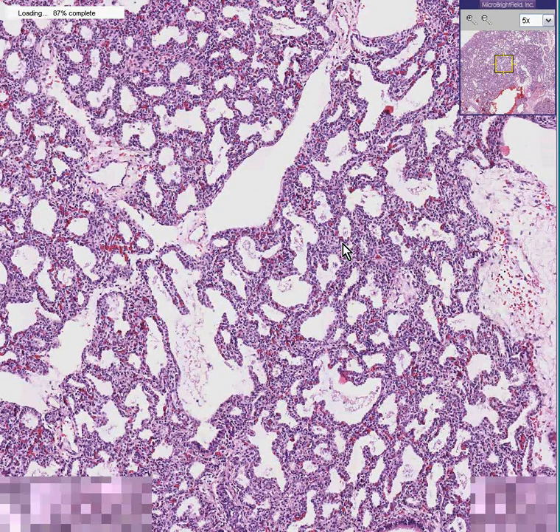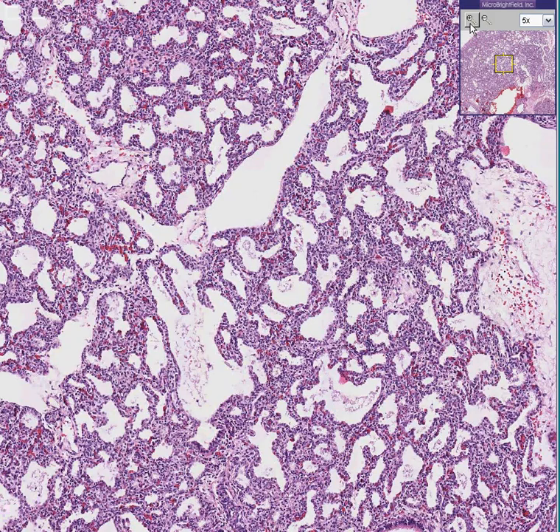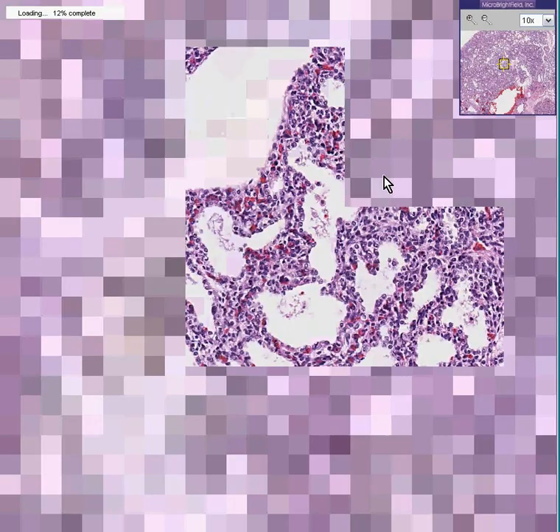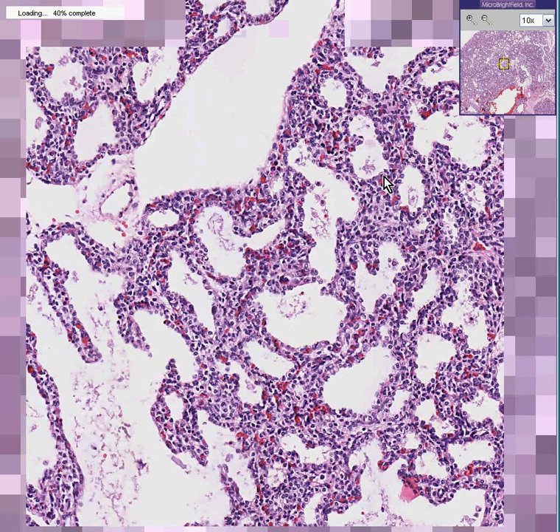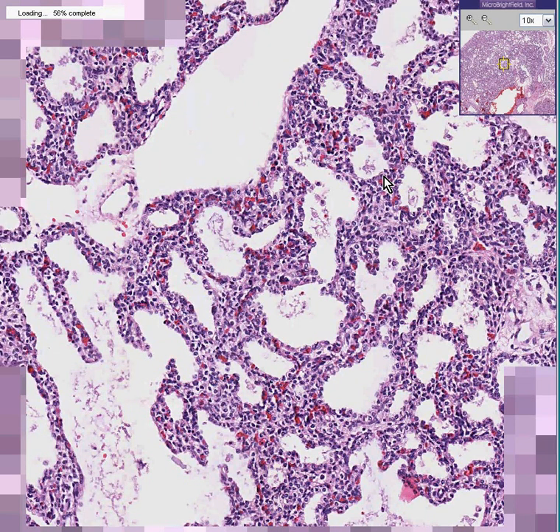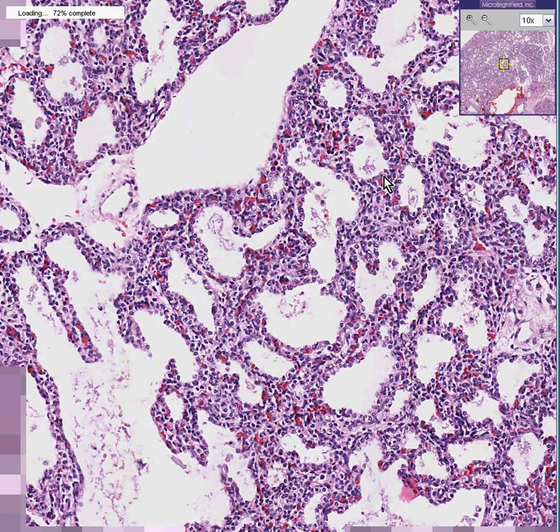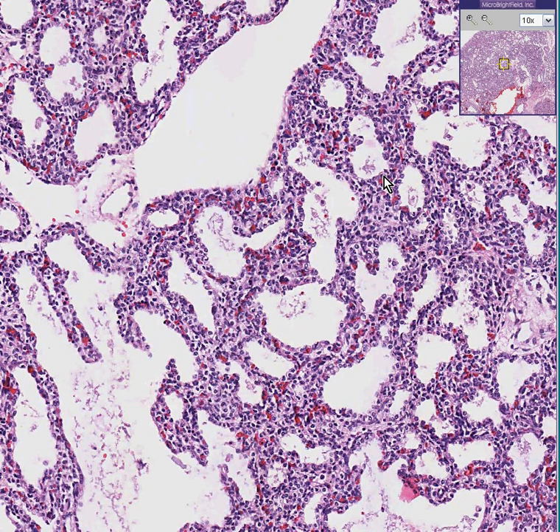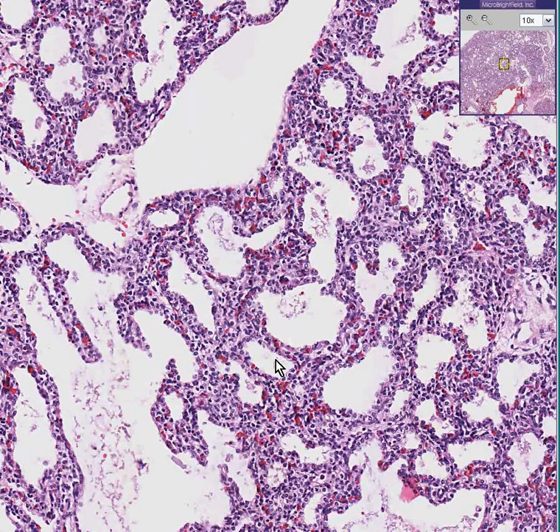This is a pneumonia, but the pattern of inflammation is not within the alveoli — it's within the septum. In other words, you don't see any type of inflammatory cells in these alveoli, but it is in the interstitial tissue between the alveoli. And for this reason, this is called interstitial pneumonia.